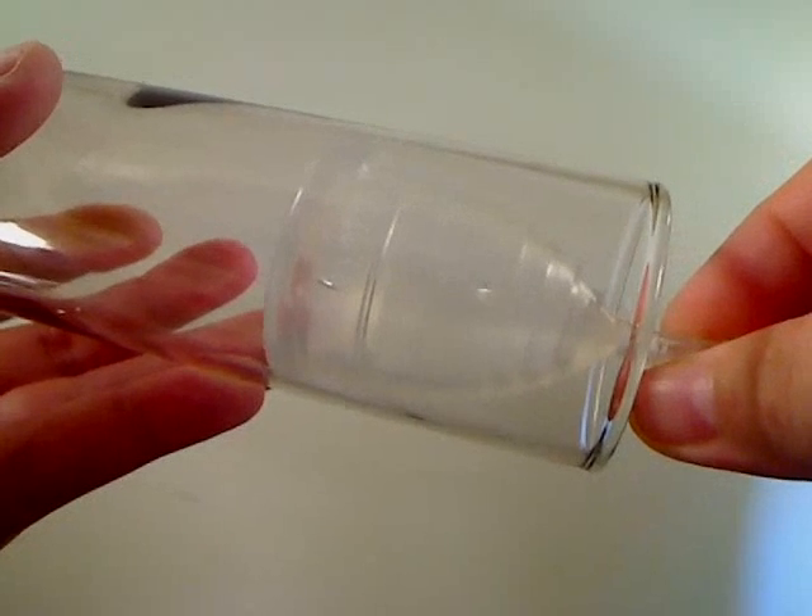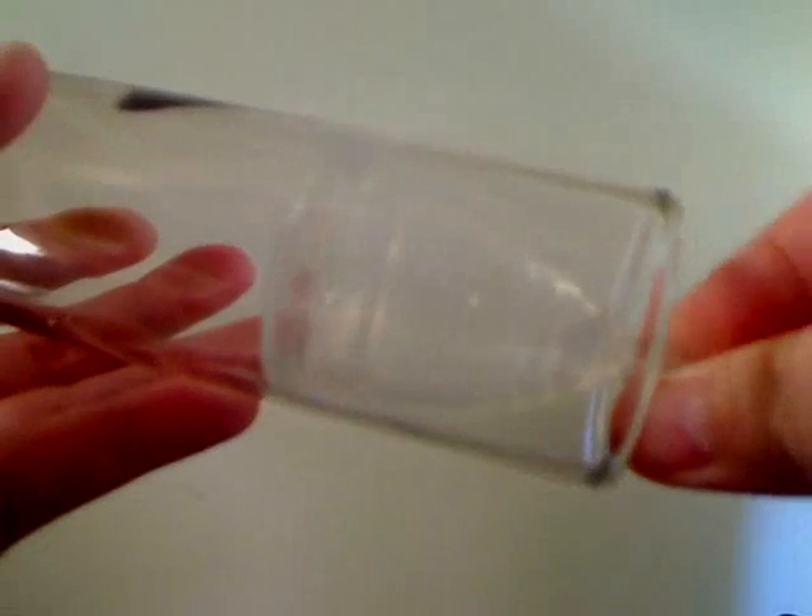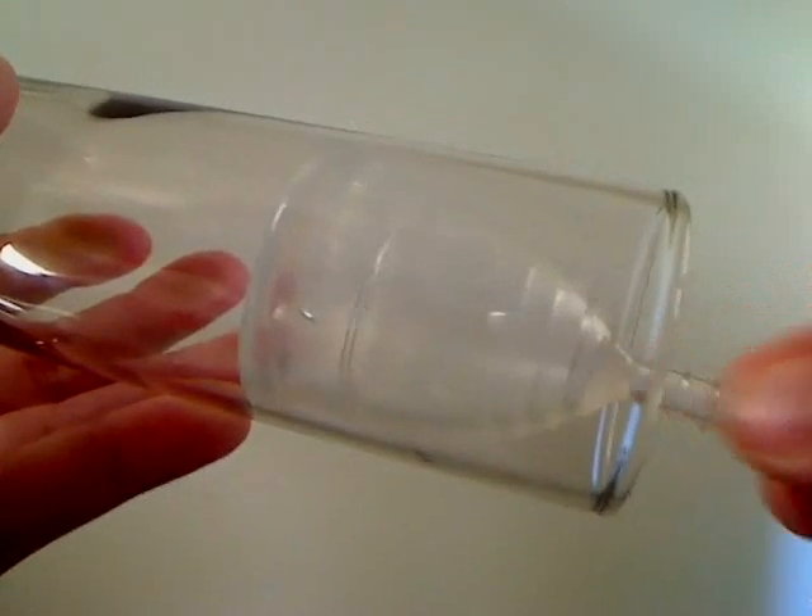The stem down here is basically just like a tampon string — it's so that you can find your cup and grab it to remove. You can trim it as short as you need it to be comfortable.